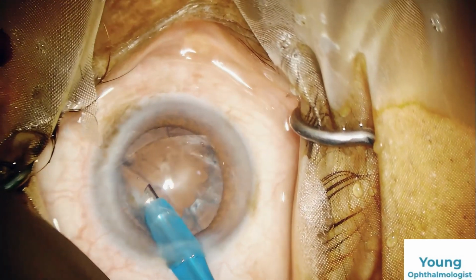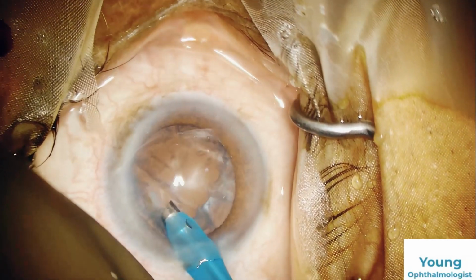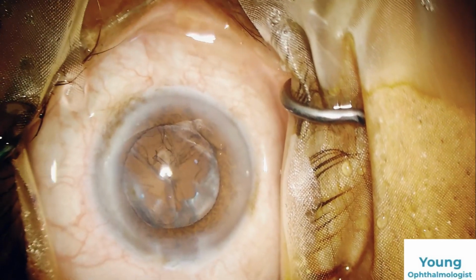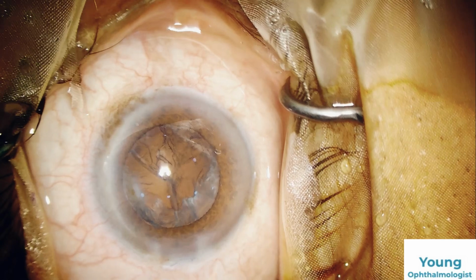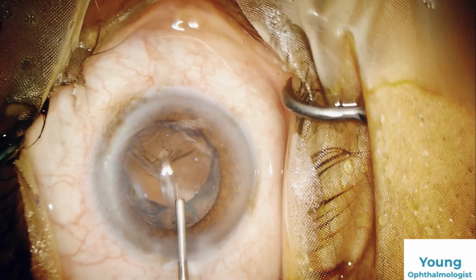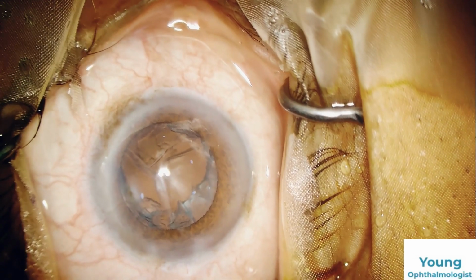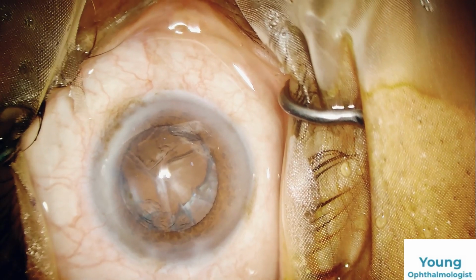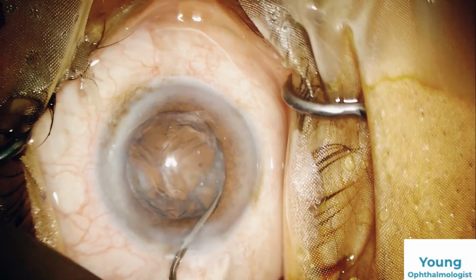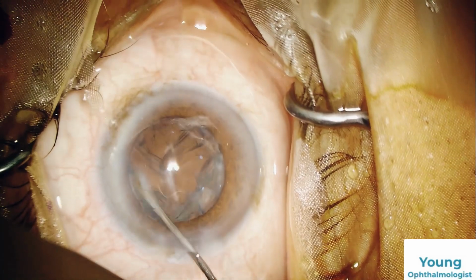So I decided to remove the phaco and to do the hydro again, pushing the visco inside the eye. Now I will do some hydrodissection again, pushing some fluid between the capsule and the epinucleus. As you can see, it's bulging upside.